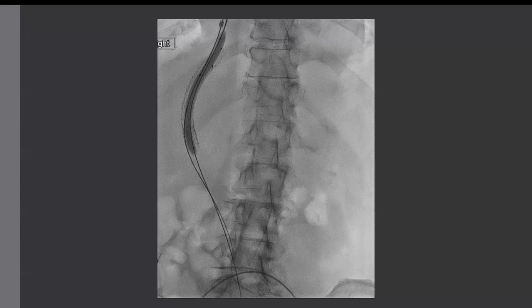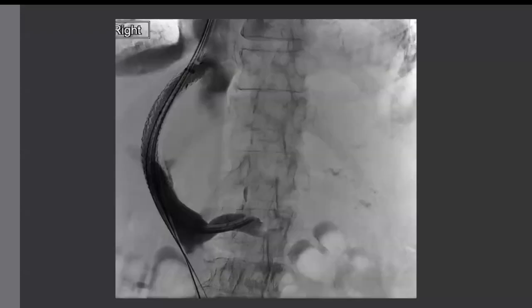And so now you haven't given up your balloon access to either of the two parallel stents. So you enlarge each one, generally just the Palmaz, but you're enlarging one stent to crush the other stent or make it smaller. So generally you enlarge the Palmaz, and as it gets bigger, it makes the Viator inside the TIPS get smaller. And so what happens is you end up reducing the amount of flow through the TIPS.